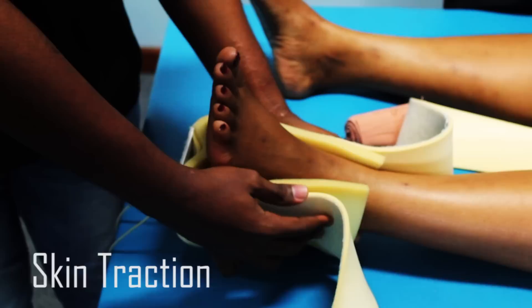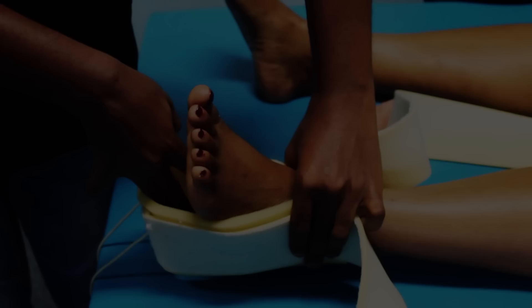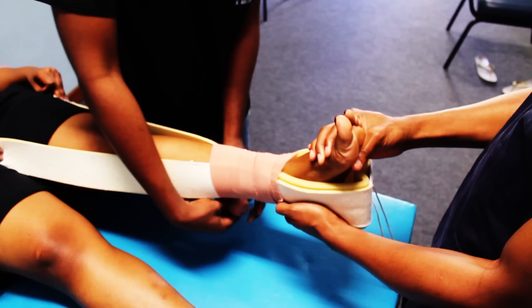With the help of an assistant, you need to apply the skin traction device making sure that the double padded region covers the malleoli. Leave 10 centimeters below the heel to allow for adequate skin traction. Start by applying the bandage above the malleoli.